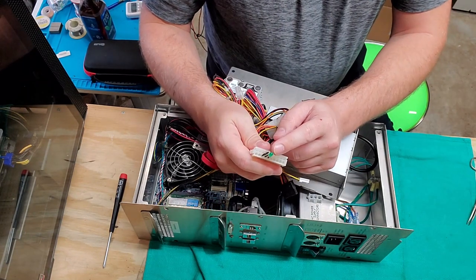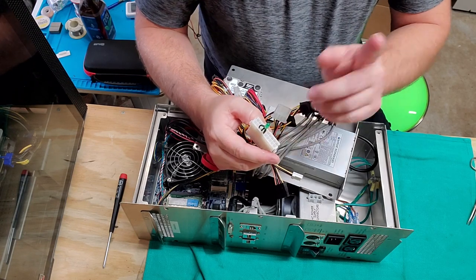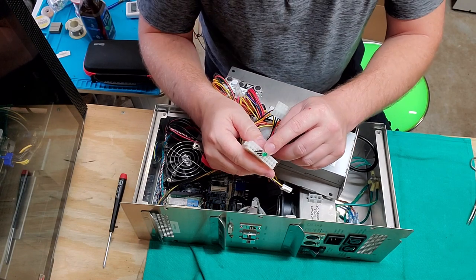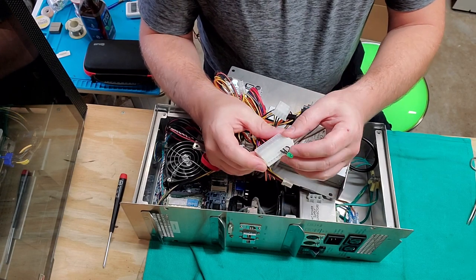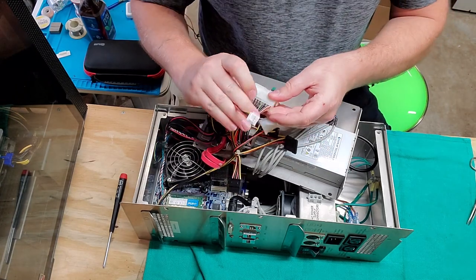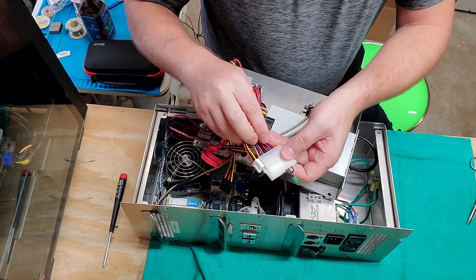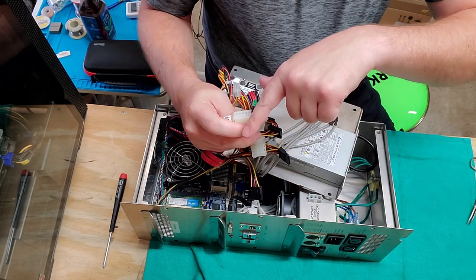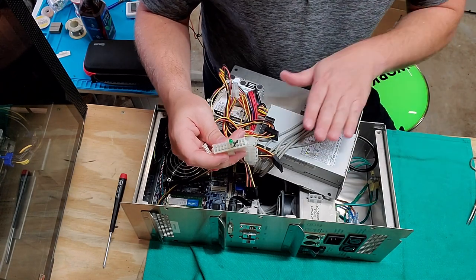I have an LED, which would normally be like the one that's on the front of your computer case. But since this one's not connected to your computer case, they just kind of have it teetering sitting in there. And I have what looks like a diode jumpering between the two pins. And if you guys didn't know, you can test any computer power supply by jumpering these two cables. You see how one of the wires is green and it's going to jumper to a black one. And you jumper these two right here. See how it goes diagonal? You jumper those two together, and that will turn on the power supply.